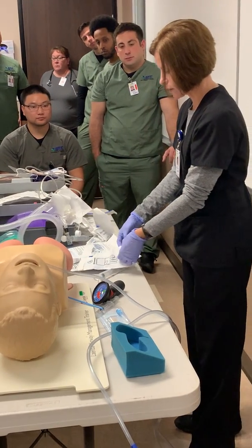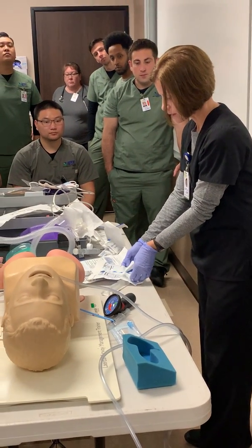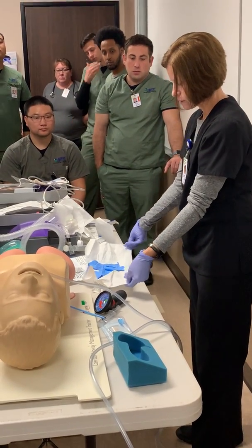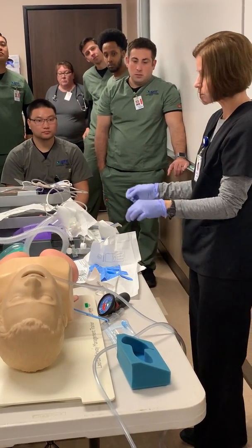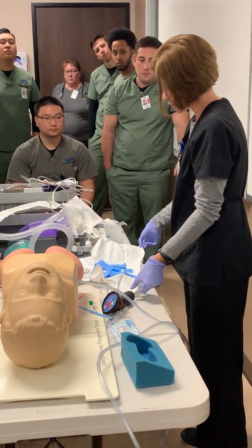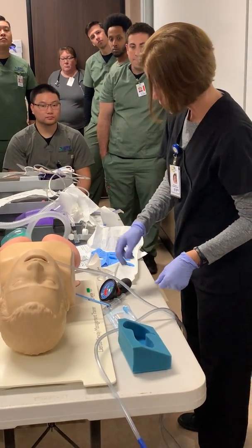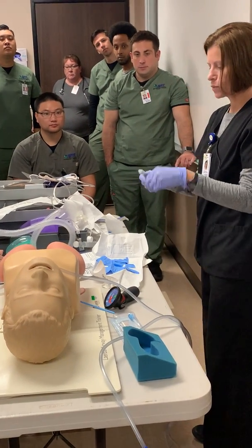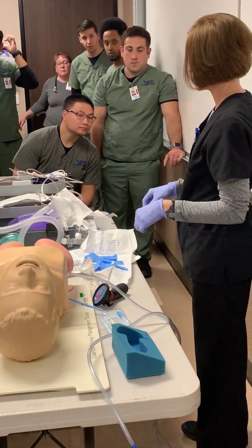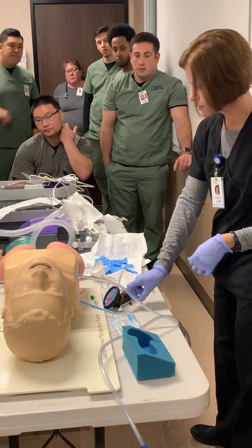I'm going to open it up, and you might have to work your hands up a little bit to fold it out. I'm okay touching just the outside edges. If it folds back, you just fold it again. So if I have my lubricant, I'm going to tear open the package and squirt it into a little bit of a corner there. Okay. So I'm just pretending.